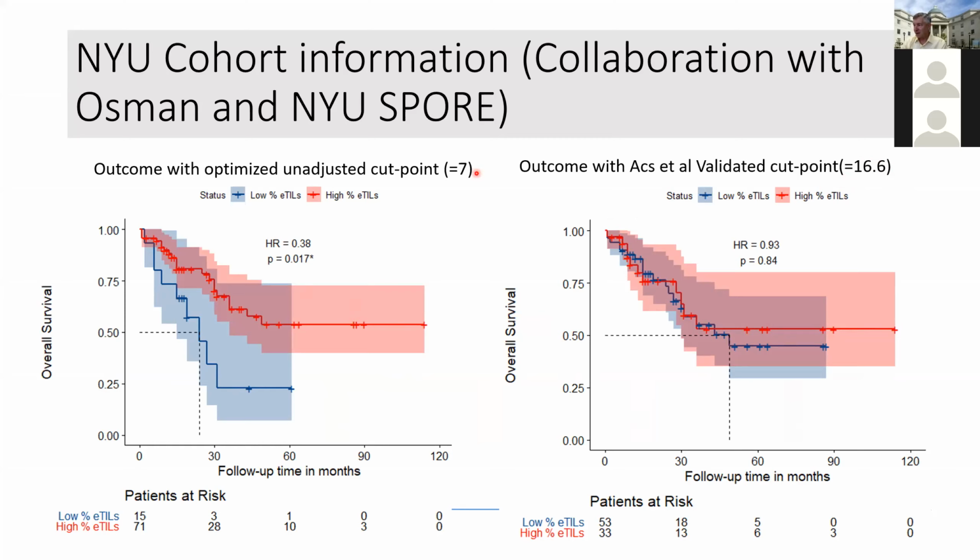And in fact, at a much lower cut point, that is detecting a lower level of TILs in higher stage, you may still find prognostic value, but you don't see the performance of high stage patients because generally they do worse. And in fact, it's hard to even do this now because so many high stage patients are getting immunotherapy.